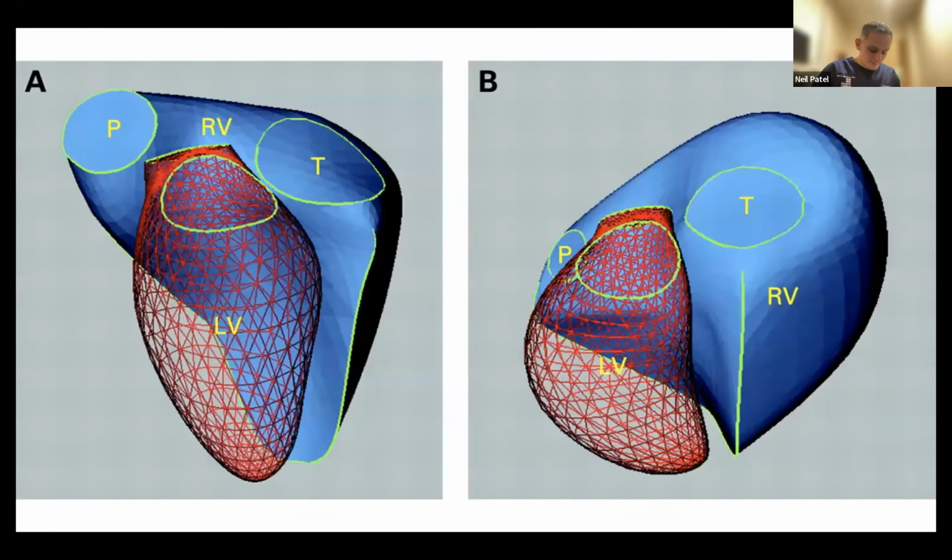So the starting point for this that I find useful is to start to think about why fundamentally are we looking at different aspects of ventricular function, and how do the ventricles function in particular? What's their dynamics at the level of the combined muscle fibers and the gross kind of change in chamber size over cardiac cycles and change in morphology over each cardiac cycle.